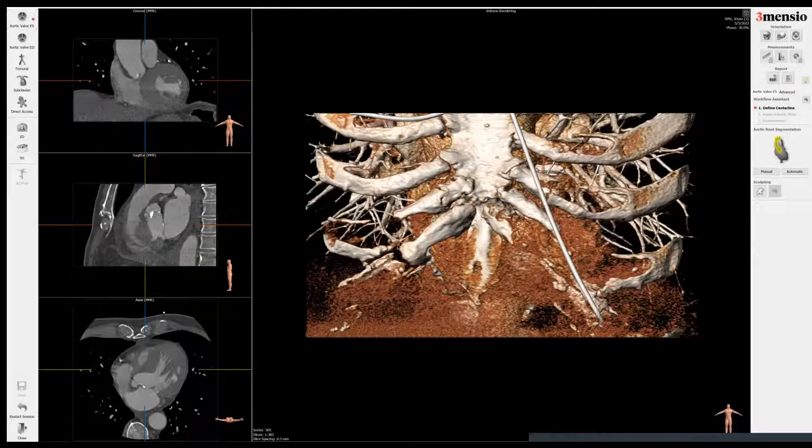Hello. Today we're going to do a TAVR workup of a patient with a bicuspid aortic valve evaluated for TAVR.